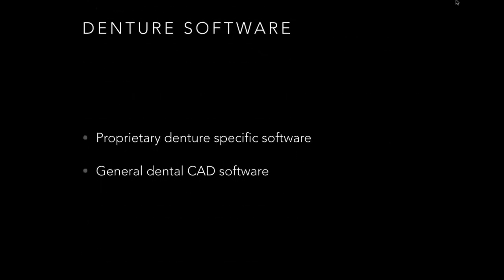Next step is you need to put your digital 3D files into denture settings software. There is proprietary denture-specific software, and that would be the Avident software. And there's also, and possibly others, general dental CAD software like ExoCAD and 3Shape, which have denture modules.